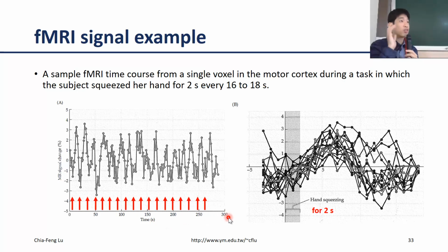But you need to understand that for the fMRI study, not only is this sequence demanded for the imaging, you also need to do the high resolution anatomical imaging, and maybe different conditions for the fMRI, and maybe you want to add in some diffusion tensor imaging or something. So normally you need to control the overall scanning time within, I think, at most 1 hour.